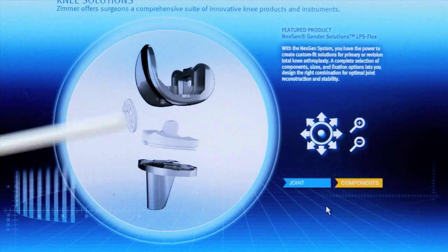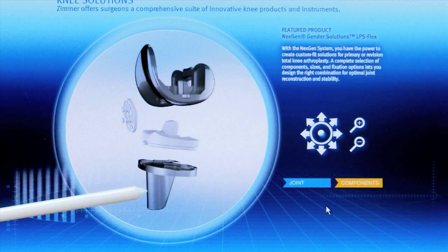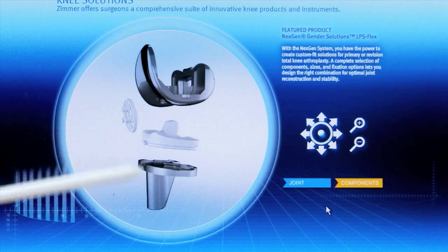That would be a plastic button were you to use it on the patella. These components are fixed to the bone with the grouting of cement, and occasionally there are types without cement on the back that the surgeon might use, but those are still being evaluated.